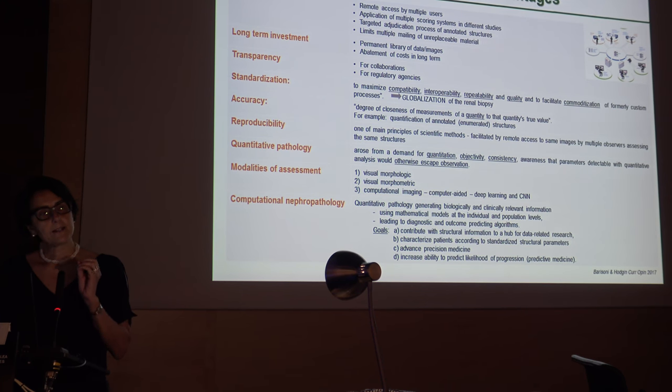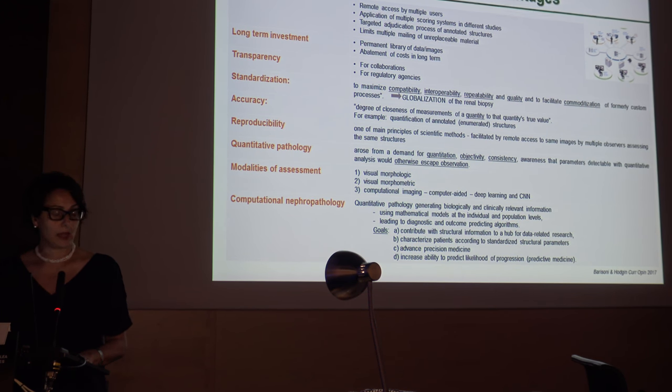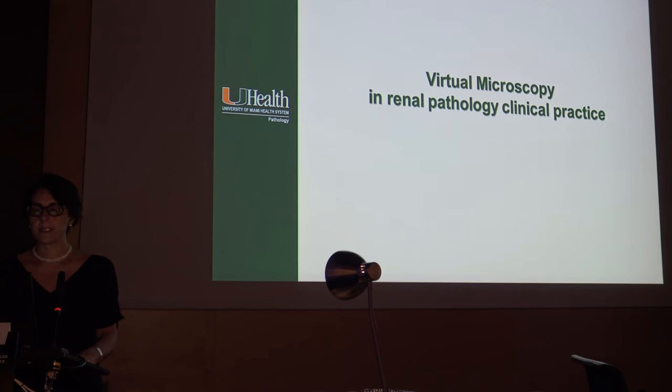It also lets us move to a new science, computational pathology, which is quantitative pathology generating biologically and clinically relevant information using mathematical models at the individual and population level, leading to diagnostic and outcome predictive algorithms. The goal is to contribute structural information to the other data, clinical data, research data, etc., characterize patients according to standardized structural parameters, and advance precision and predictive medicine.